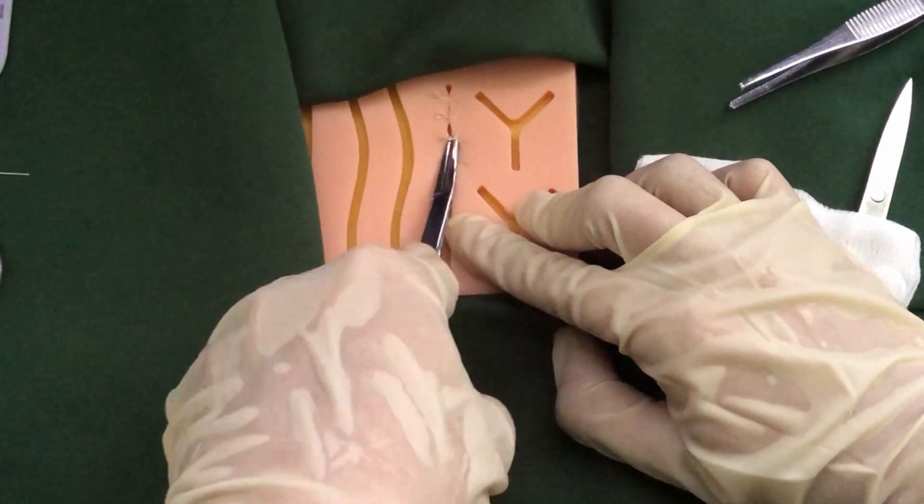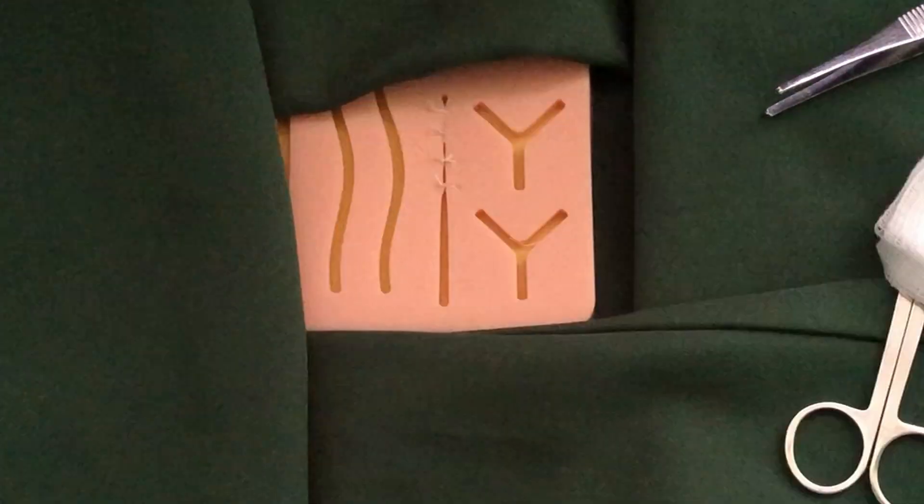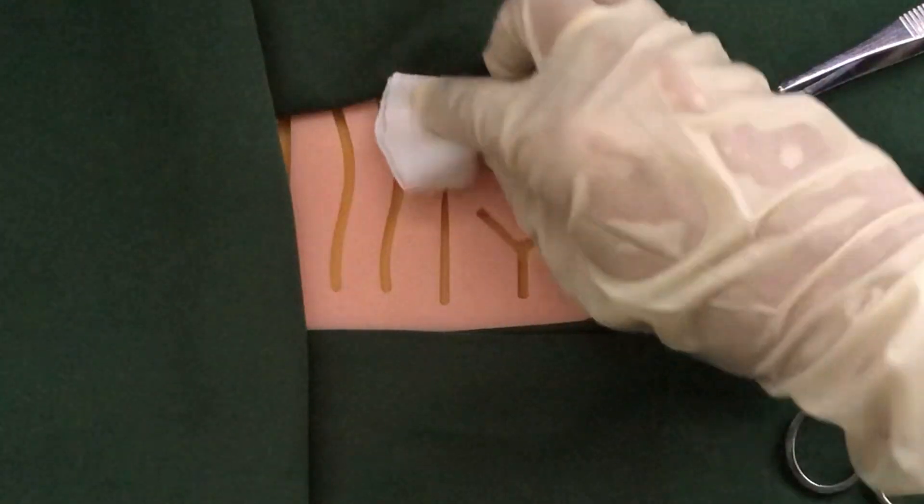Test the integrity and strength of the sutures using a curved Kelly. Do aftercare and observe proper waste disposal.